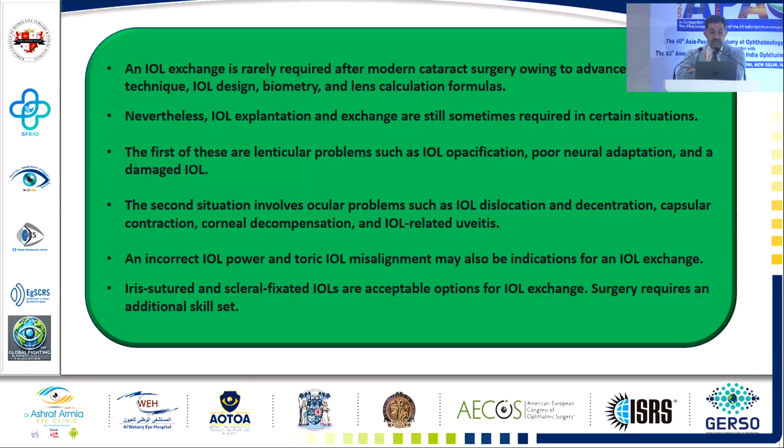An IOL exchange is rarely required, because in modern cataract surgery we are usually meticulous in choosing the IOL and the site of the IOL. Owing to advances in surgical techniques, IOL design, and biometry, everything has changed. Nevertheless, IOL explantation and exchange are still sometimes required in certain situations, and you should know how to do it.